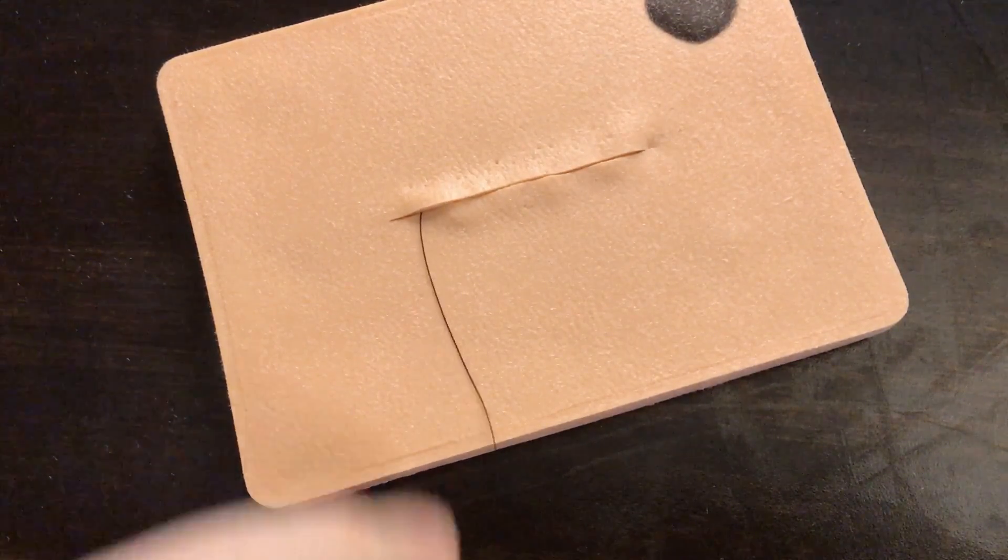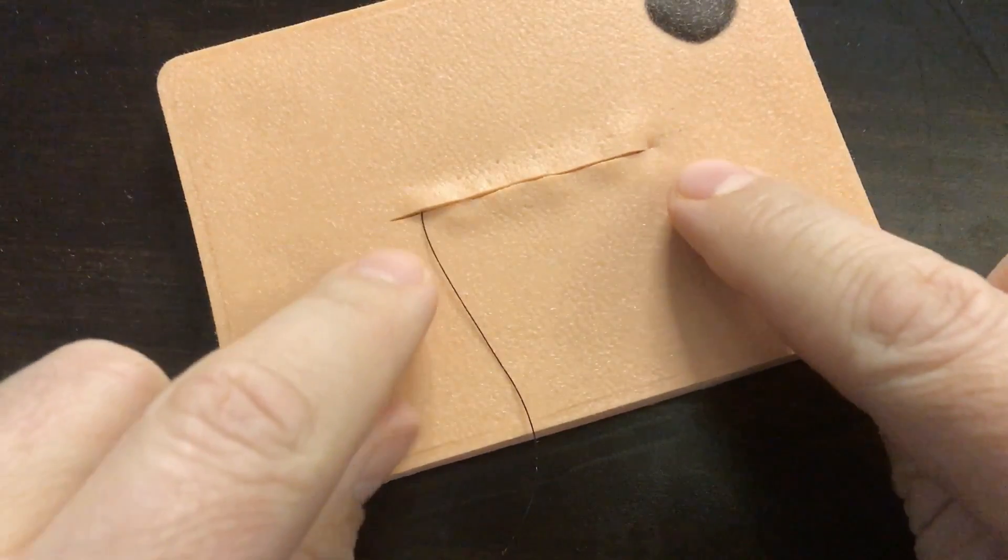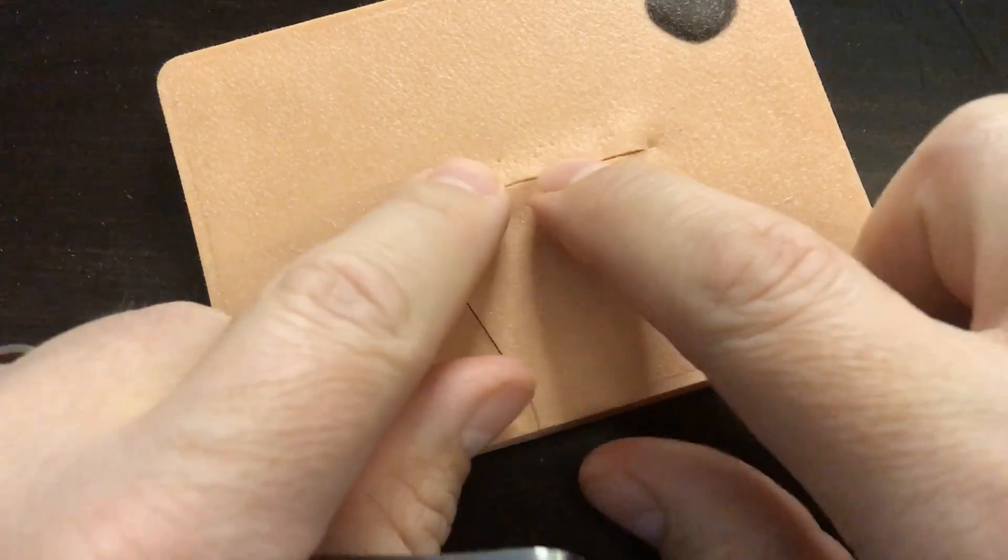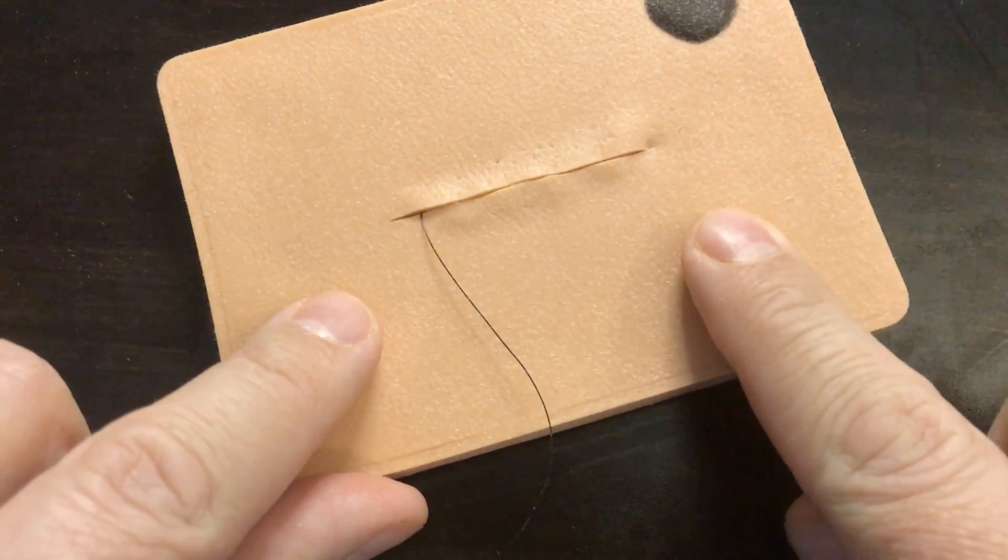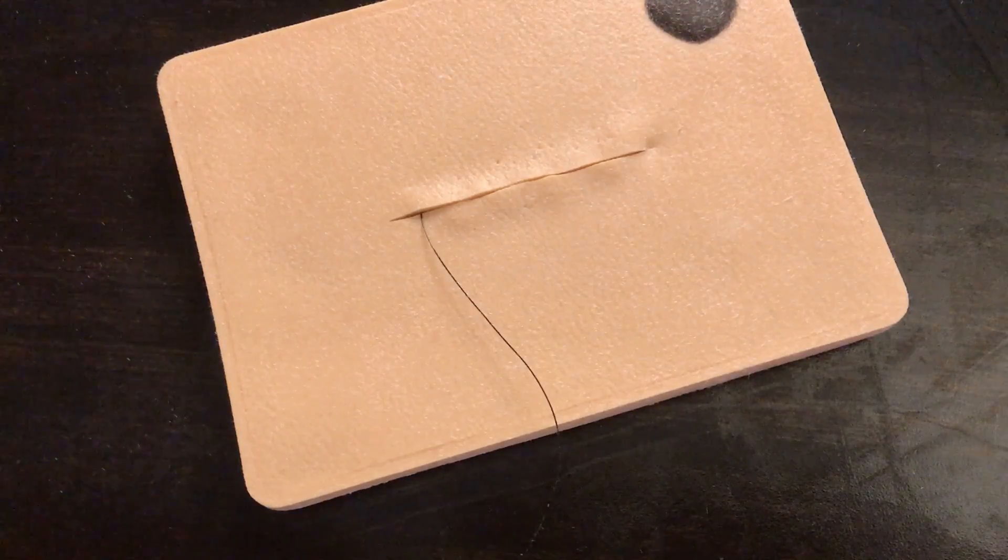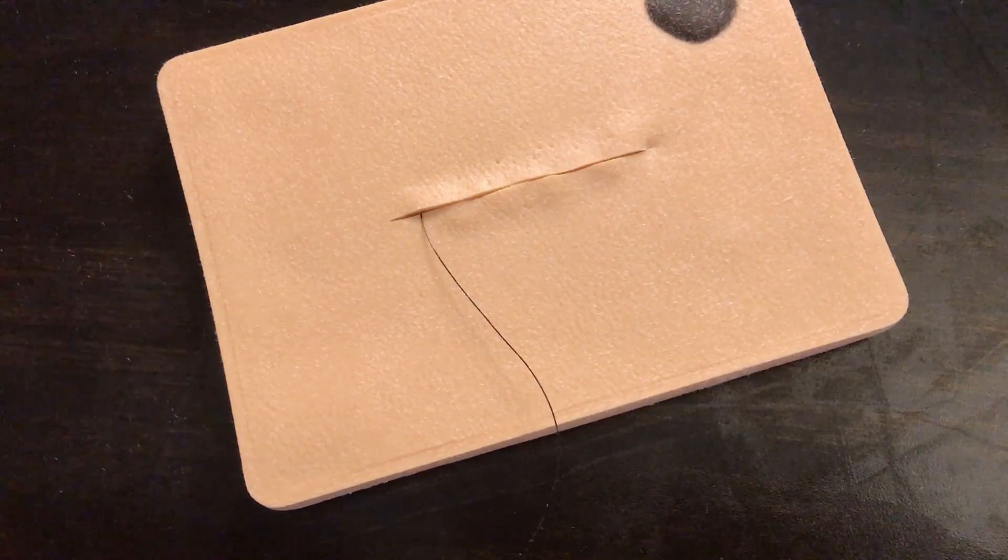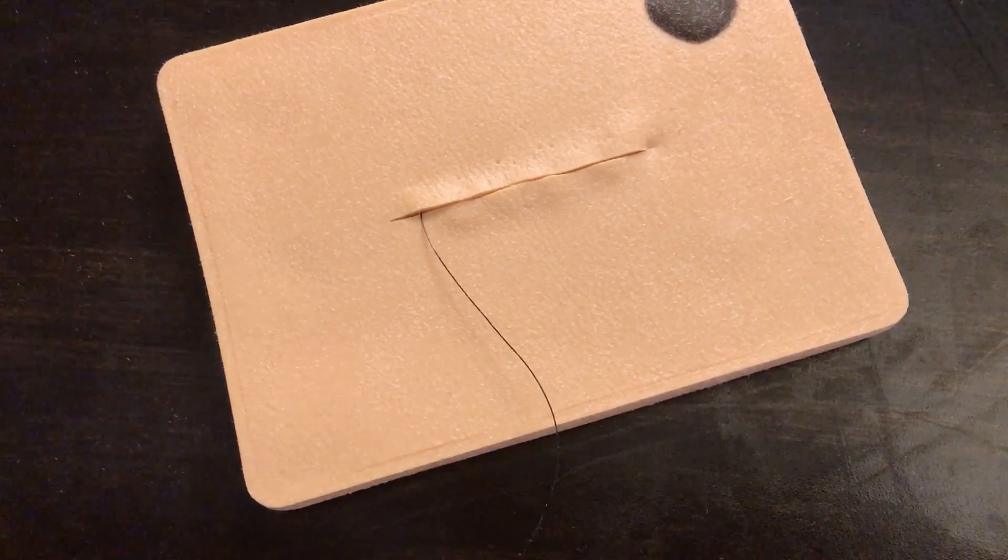Alright, so we're getting close to the end here. And see, it's lying pretty flat now. It may seemingly buckle up in a couple of locations where it doesn't lie perfectly flat like the rest of the skin. That's okay, that's to be expected, especially if you're suturing subcuticular on a place that is softer skin, like somebody's neck. Especially the older somebody gets, the skin on the neck gets pretty thin.